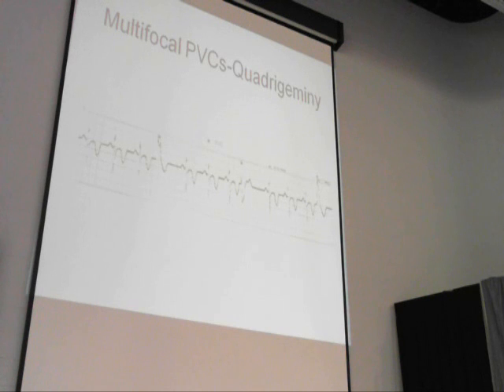And what did we say was the normal time frame, or the width, of a normal QRS complex? 0.04 up to 0.12 seconds. One little box up to no more than 3 boxes when you go across its time. So what characterizes a PVC: there's no P wave associated with it, and the duration is always greater than 0.12 seconds. It's fat. It's a wide QRS. No P wave. Duration, if we measure it out, is greater than 0.12 seconds.